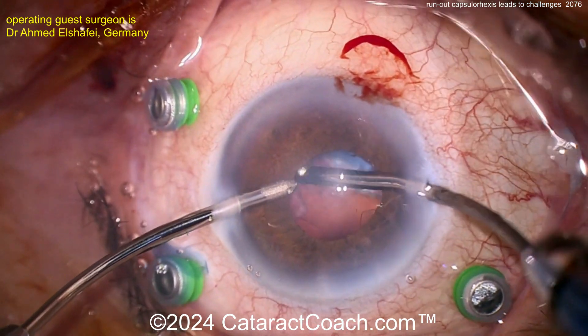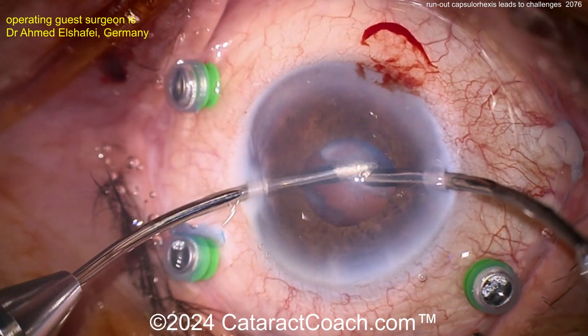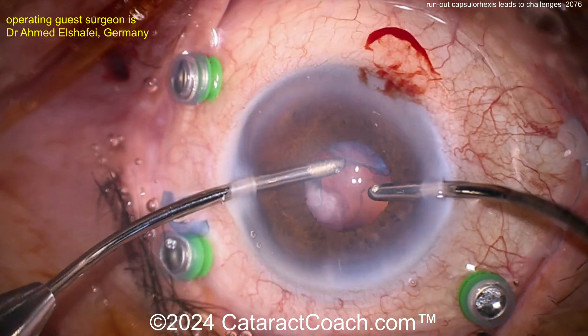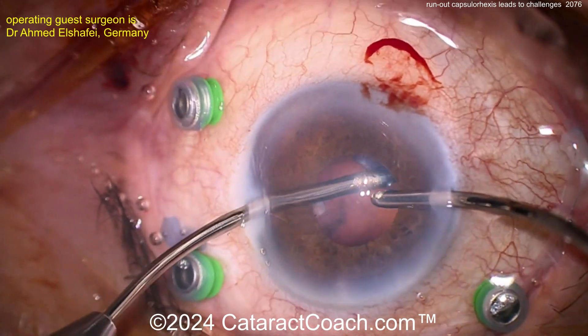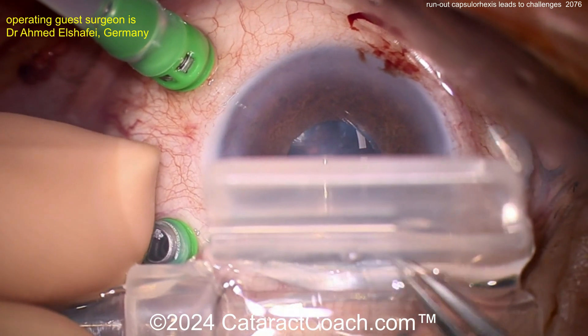We're still not sure exactly what's going on with the capsule. Is the capsule rexis still tiny? Did it run out? Is the posterior capsule intact? What do we have in terms of options for IOL support? Vacuuming more of that stuff out of there — that looks pretty good. Here comes the lens.